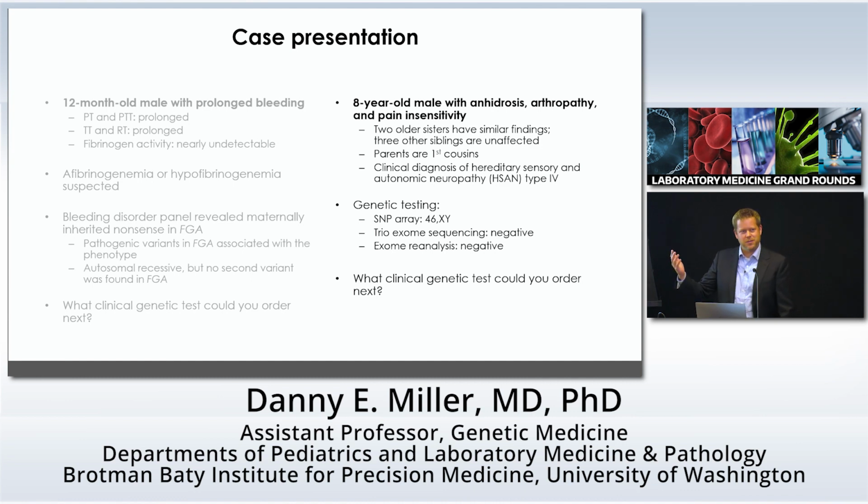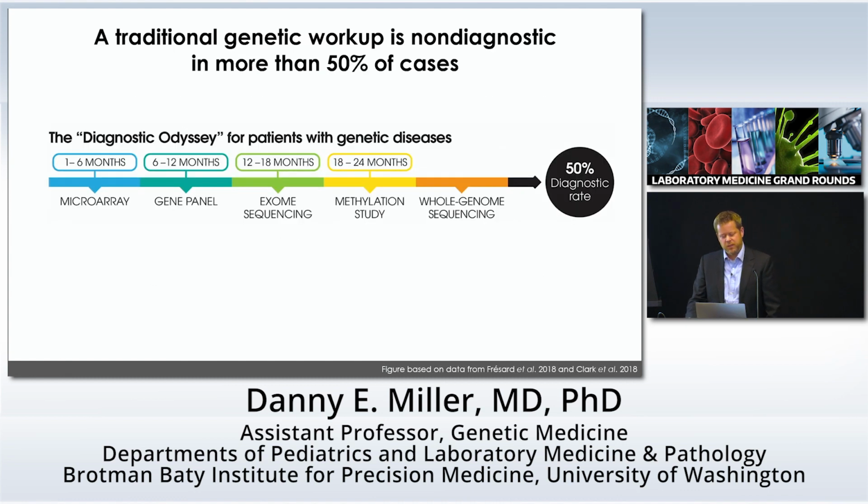This is clearly, it's screaming it's genetic, right? But we don't know why. So how would you approach that case? And it's cases like this that got me interested in long-read sequencing, and it's really the workflow that we go through in these cases.